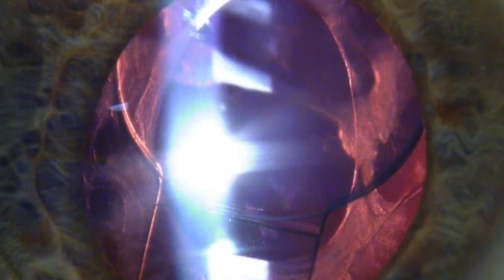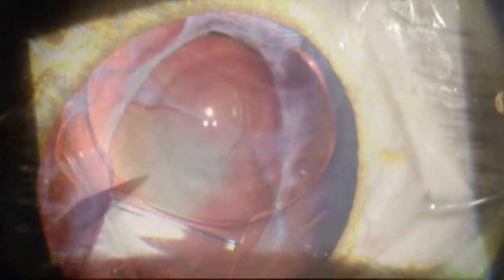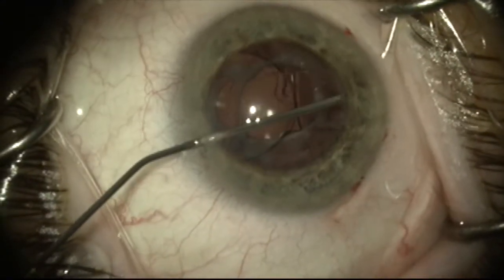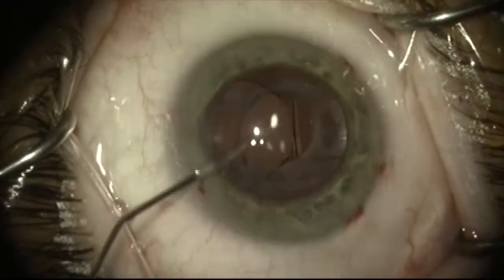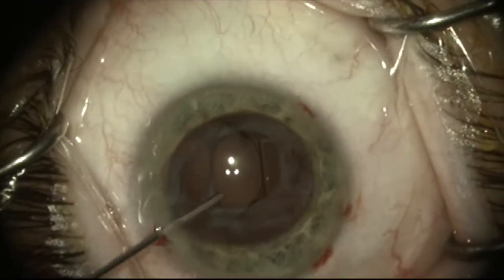This is a patient who is status post femtosecond laser-assisted cataract surgery. She developed a severe Z syndrome and was treated with YAG laser multiple times. It did not resolve and she has five diopters of astigmatism. She is referred in from out of town for lens exchange.